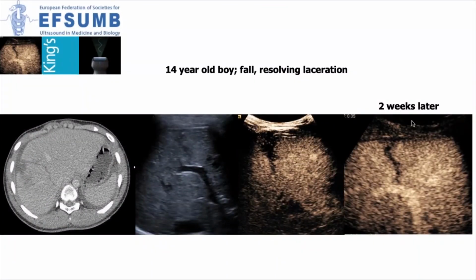And indeed, in the follow-up, even of quite complex lacerations, you can see the progression over time. And it's very easy to take the same images each time if you need to. And video loops and cine loops allow us to clearly delineate what was thought to be very operator dependent previously.